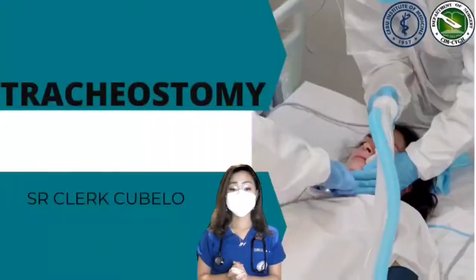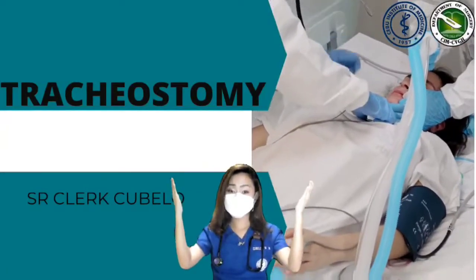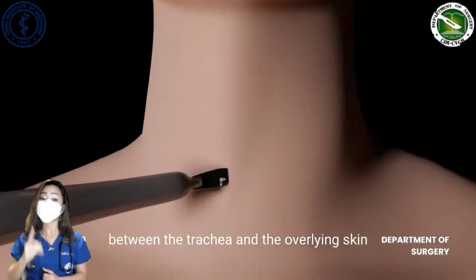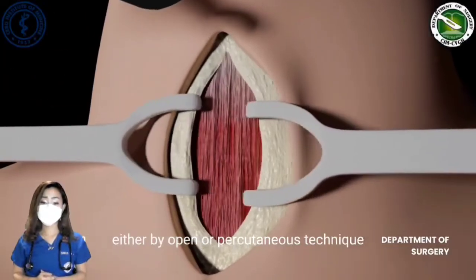And for today's episode, I will be demonstrating how to perform a tracheostomy procedure. Tracheostomy refers to the creation of a communication between the trachea and the overlying skin. This may be done either by open or percutaneous technique.